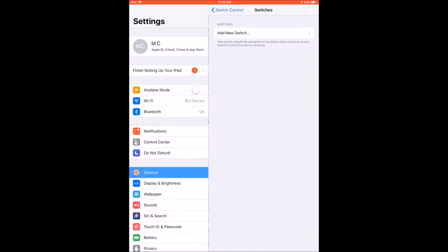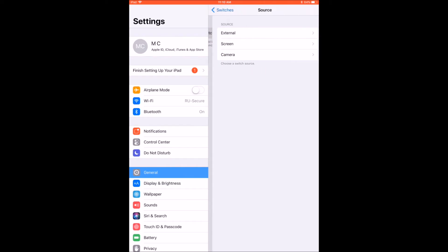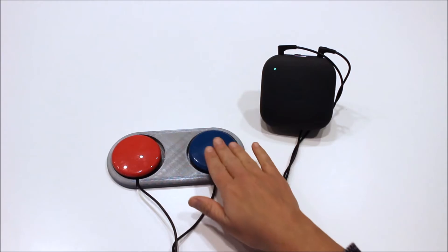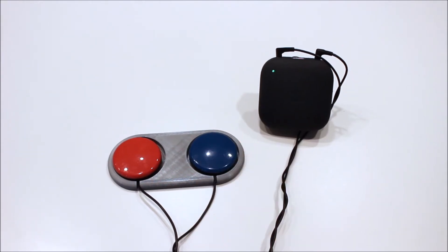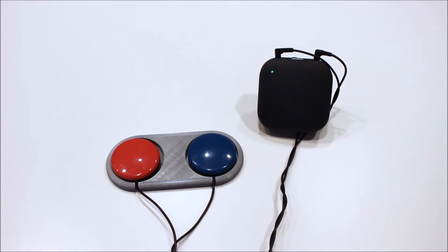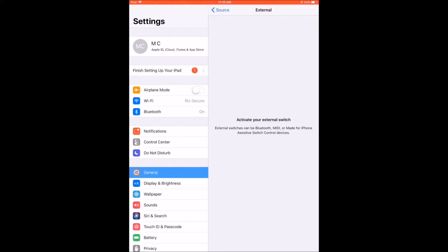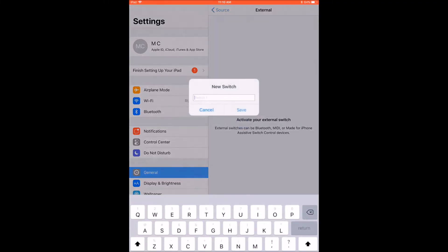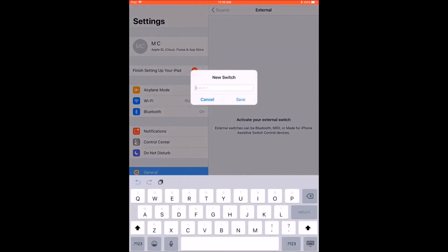Click on Switches, and then click on Add a New Switch. Then, select External as the source. Press the switch connected to the Tecla-E. In the pop-up window, type a name for your switch, and then press Save.